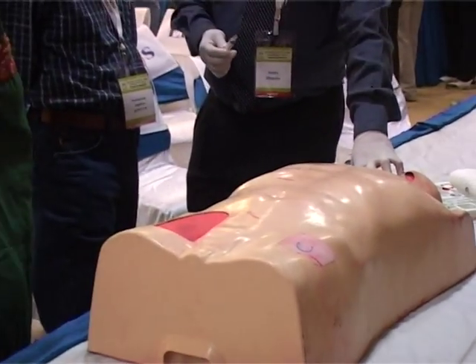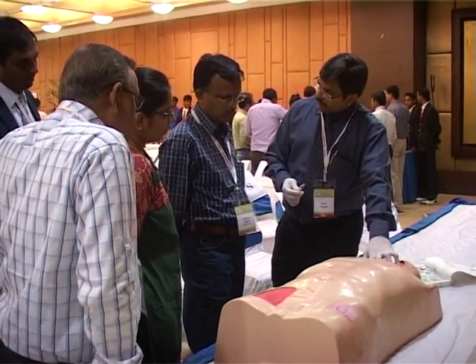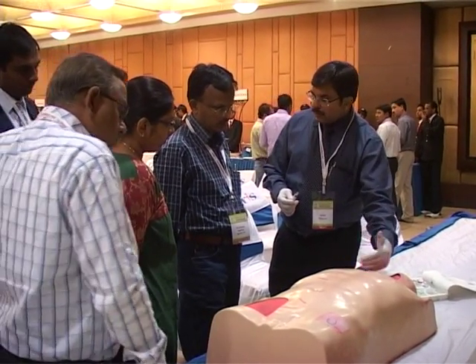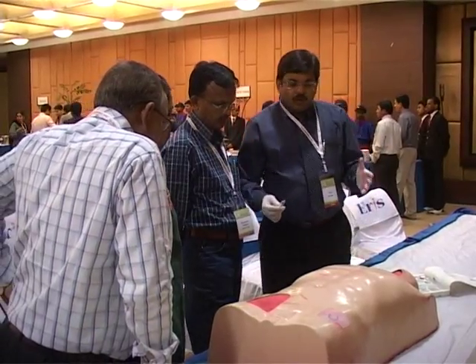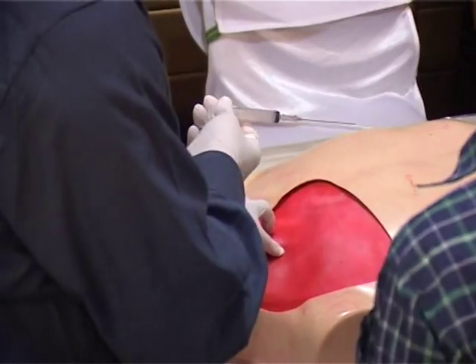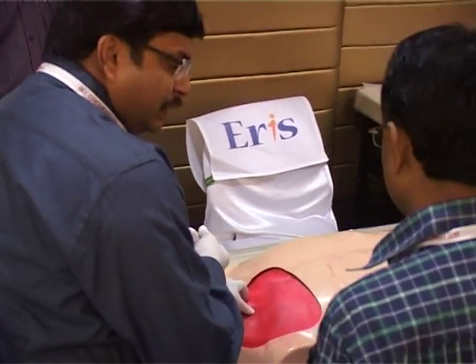With the posterior approach, the chances of picking the artery are less, because you can see the vein is here and the artery is there. So you are always going to hit the vein first. Whatever technique you use, you should know the landmarks.